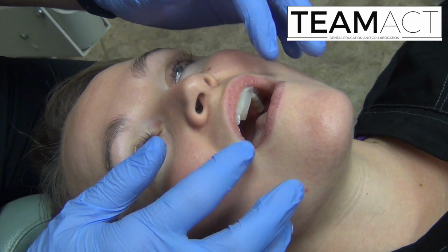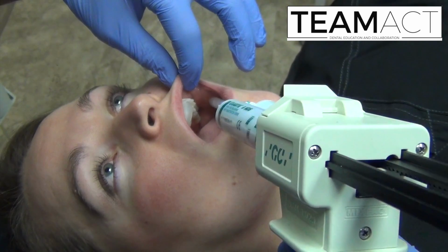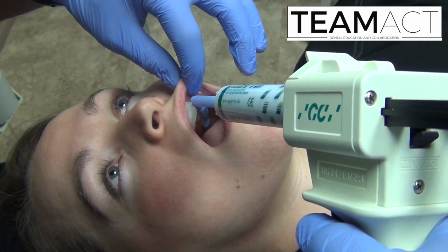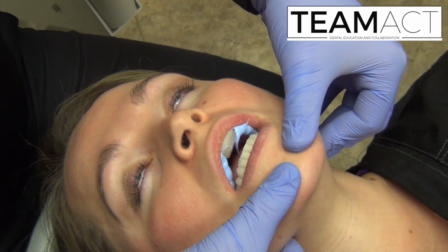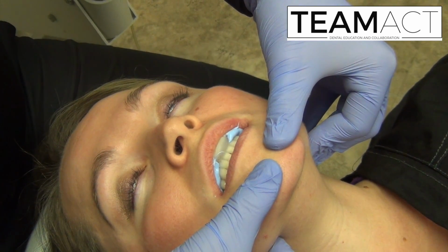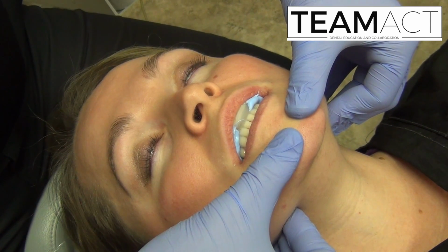Once the jig is fully cured and I have confirmed the repeatability of the jig to record the CR position, I will then apply GC Exabite registration material to the maxillary posterior teeth. Notice I'm applying just enough that I will be able to record both the maxillary occlusal surfaces and the mandibular occlusal surfaces. I will then support her mandible properly as previously described and have her close into that triad jig and remain there supporting her mandible until the bite registration material has fully cured.